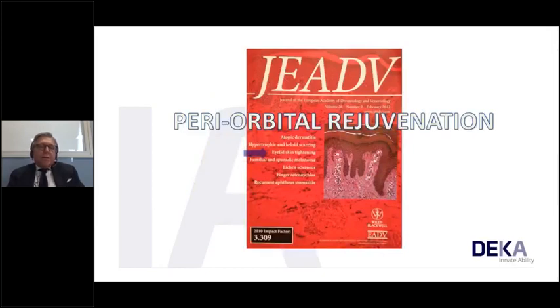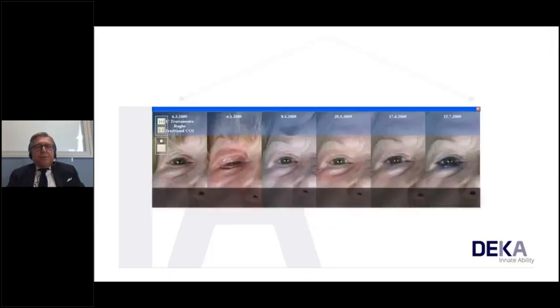We published in 2012 in EADV the fractional treatment of the eyelid, and you see the sequence of the appearance. Immediately after the procedure, we have a peak swelling that is around 24 or 48 hours, and a peak redness around 24 to 72 hours, or sometimes 4 days, but rapidly tapering off into new pink skin and firm skin.